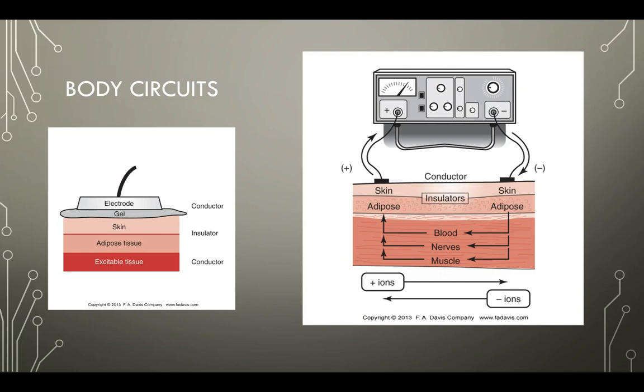Some of those have to also have what we call a transformer, which would take the DC current and turn it into an AC current. Those would be like our TENS units or our iontophoresis unit, which does iontophoresis, the delivery of medications. That takes a battery, a DC current, and keeps it a DC current. Then we can modify that wave based on the parameters we set. So the generator forms the wave and then we get to alter it with our parameters.